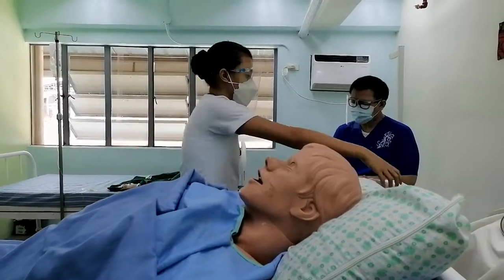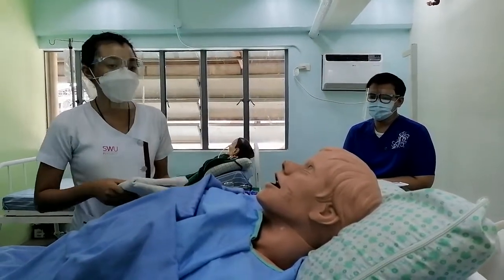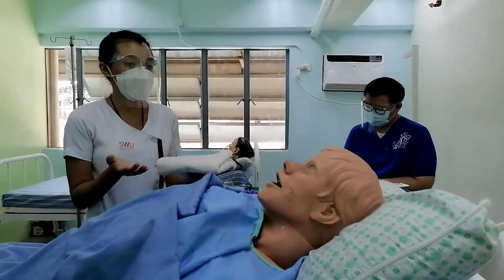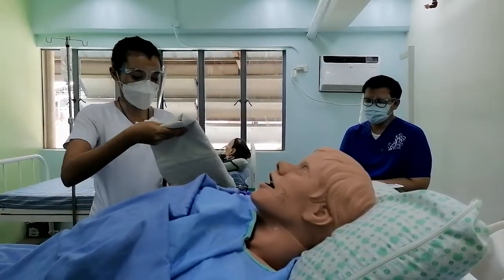And then I will cover the patient's chest with the towel, because this will serve as a basket for any oral secretions while doing the procedure.